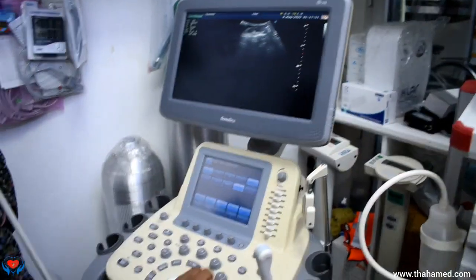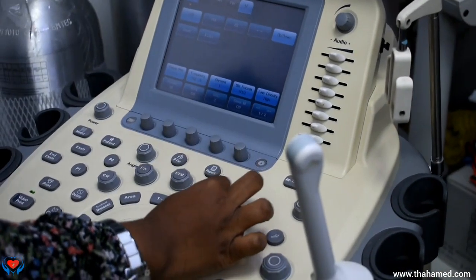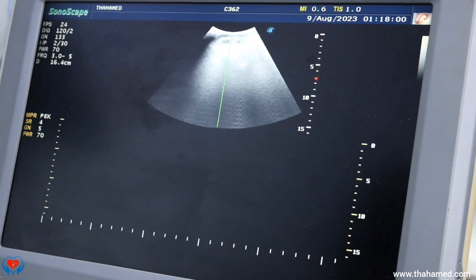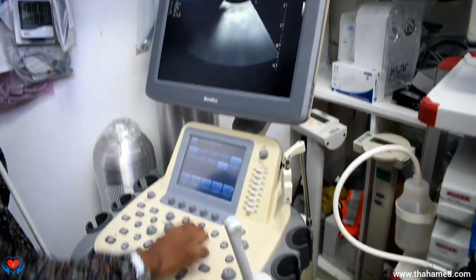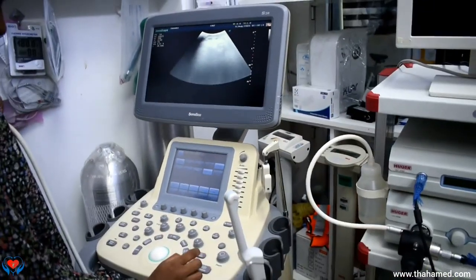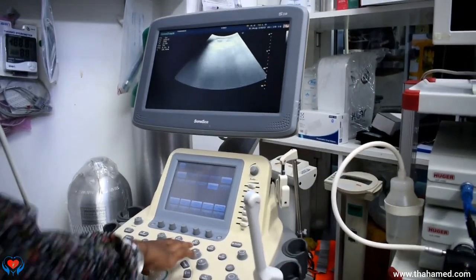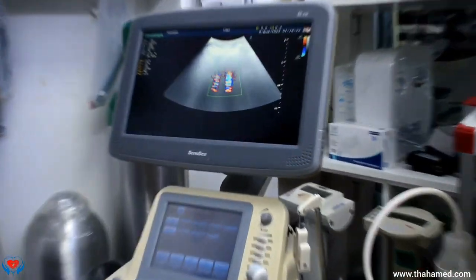And according to the image, the measurement will be denoted over here also. Likewise, there are other modes also, that is M mode. Here we can change the clarity, and the motion image will be obtained. If you want to zoom in, we can zoom by changing this cursor. If we press the CFM, we will get the area which we are interested in.